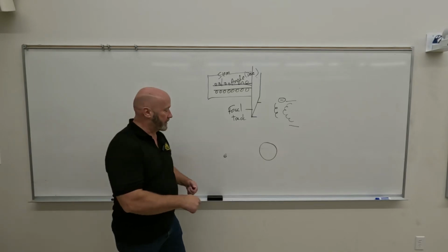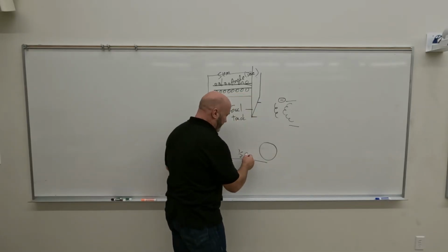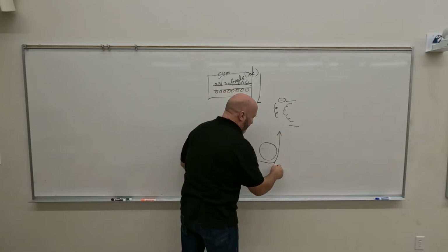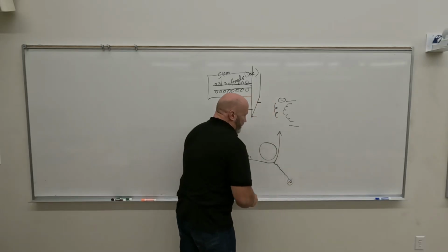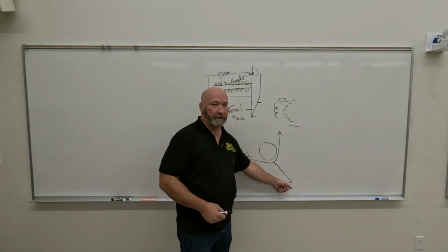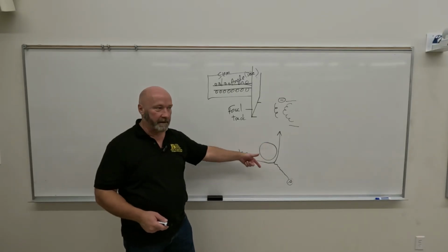Right. So these electrons coming in, approaching the speed of light, maybe half the speed of light, are really moving across the tube. And when they change direction, that energy has to go somewhere, and that is going to be an X-ray photon. So what controlled the energy of that photon? How close it was to the nucleus and how much energy it lost, right?